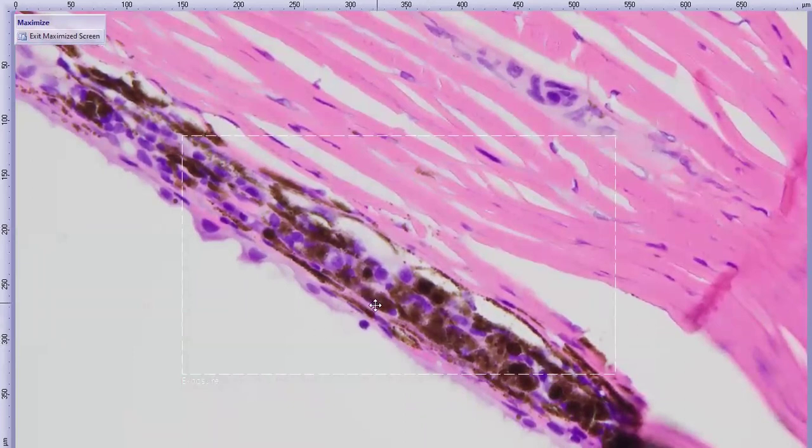And in some of these areas, you may imagine that some of these cells are a little bit rounded, the ones that are laden with melanin. And so there's likely a couple of melanin-laden macrophages in the choroid stroma as well. So what we have is a lymphoplasmacytic panuveitis, kind of mild in this case, pretty low profile, which is associated with a few melanin-laden macrophages. So interesting.